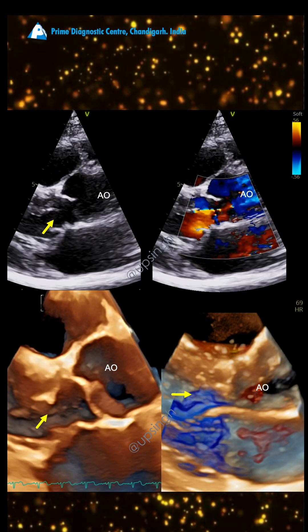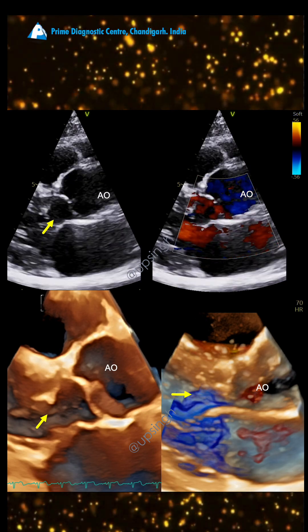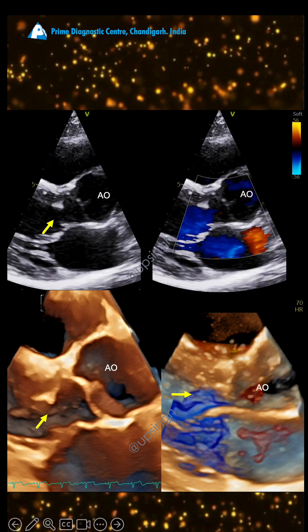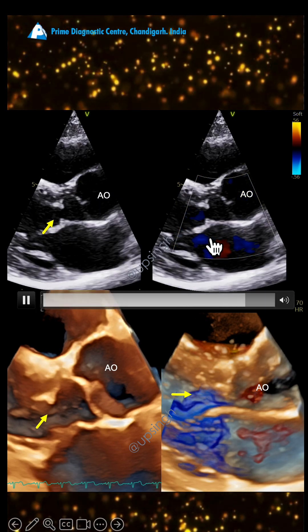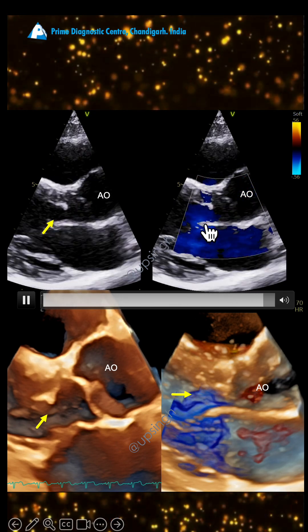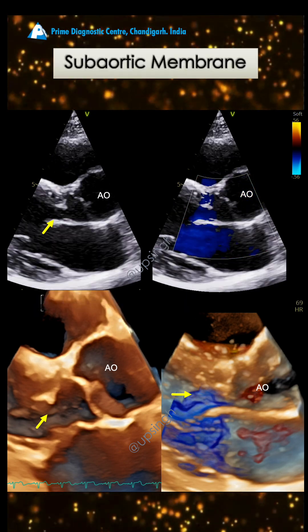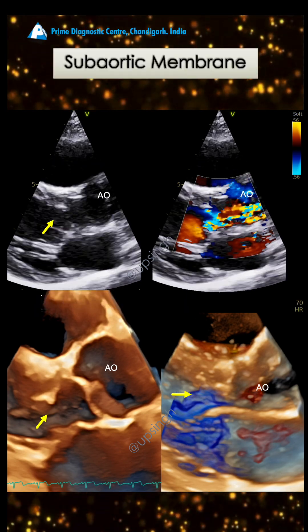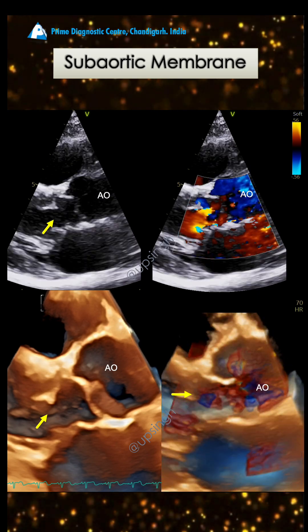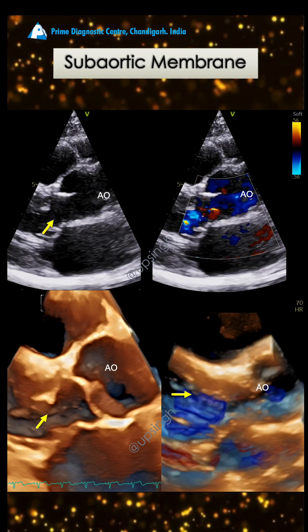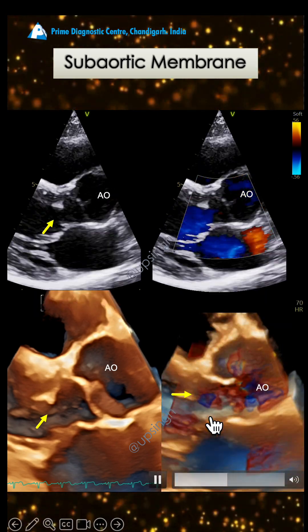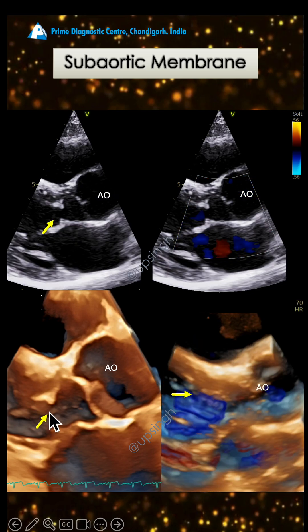This is a parasternal long axis view where you see a sub-aortic membrane marked by an arrow, and you see aliasing right where the sub-aortic membrane is. So there is a sub-aortic membrane below the aortic valve. On the color Doppler, you can see the aliasing happening before the aortic valve, at the sub-aortic membrane level.